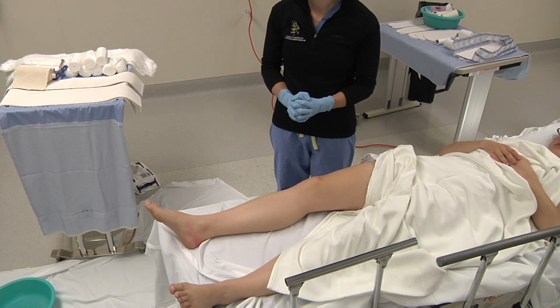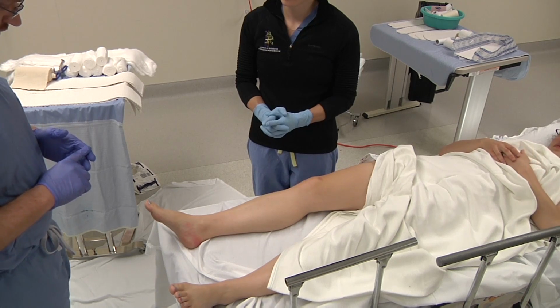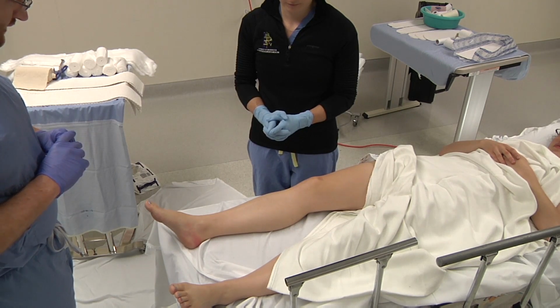The splint material that we are using does not use a catalyst, so the water temperature can be room temperature to lukewarm with little concern of burning the patient. We have plenty of web roll. We have evaluated our x-rays and determined what maneuvers we need to do for a reduction. And we will begin. First thing, the patient has received appropriate analgesia, either in the form of IV pain medication, conscious sedation if required, or a hematoma block of the fracture site.